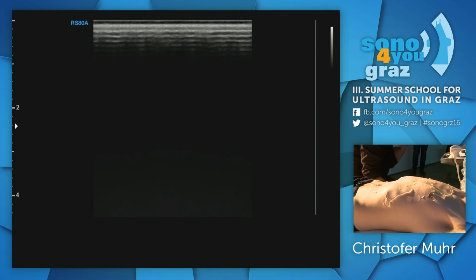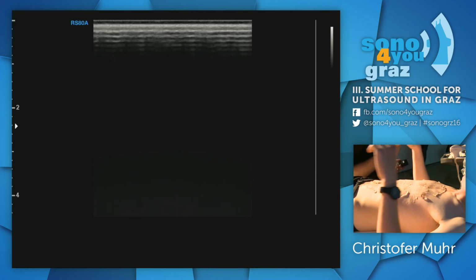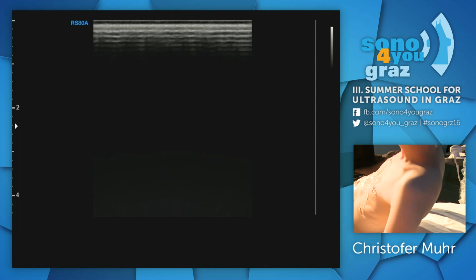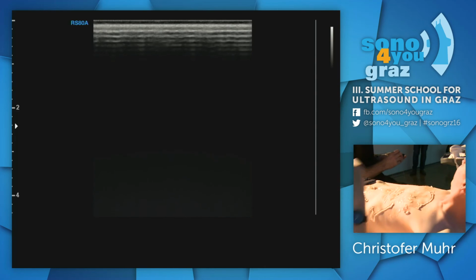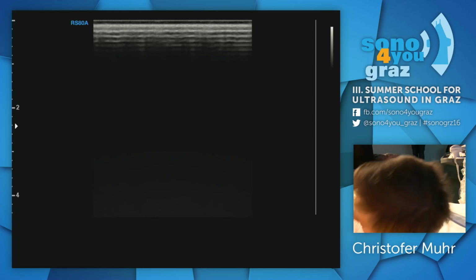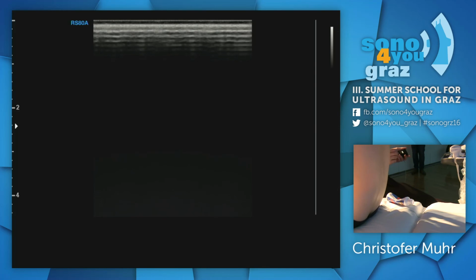4 minutes 25. Sorry? 4 minutes 25. Oh, the patient died after 1 minute. Too much talking, eh? All right. Any comments? You happy with this? So now you know RUSH. Well, I think the patient is alive. And I think that was quite a demonstration here.